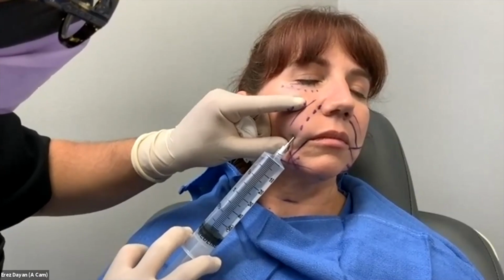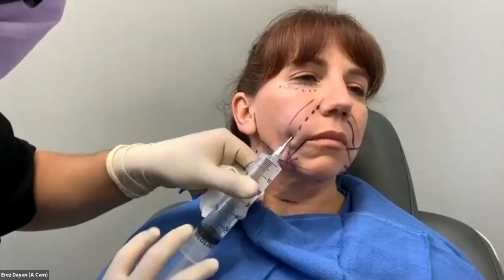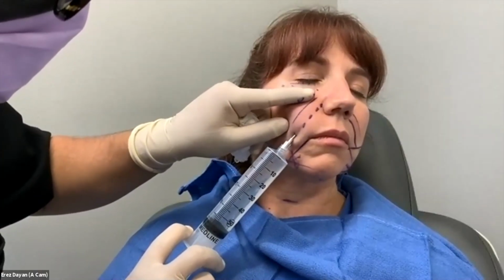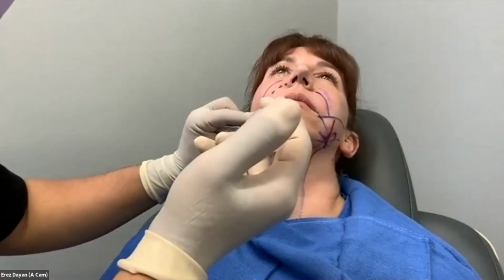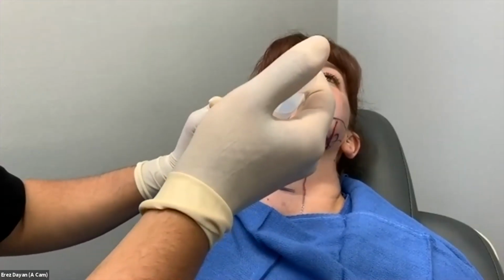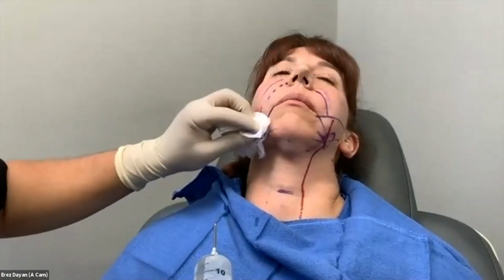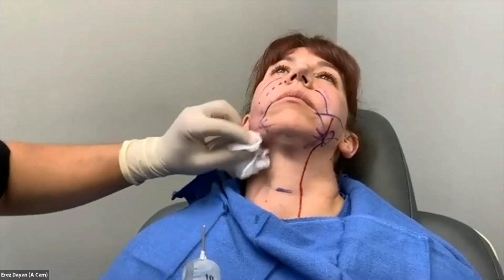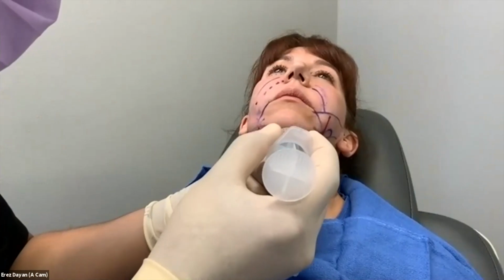You feeling that very much? So she's not on any sedation, this is straight local. Again, I'm pretty generous with the tumescent. Some people are less generous. For small cases like this, now if I'm doing a full face, then I will use a tumescent cannula because I've got to get through the whole neck, and so it's a little bit more involved. You feeling okay? Is it pressure or is it a combination? Combination? Okay. Is it sharp? No. No. Don't be too tough here.